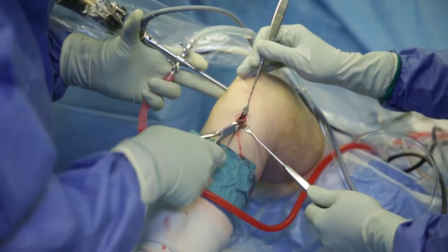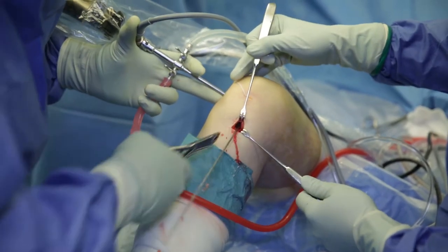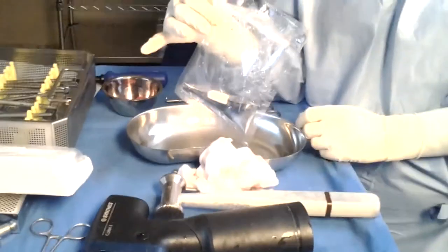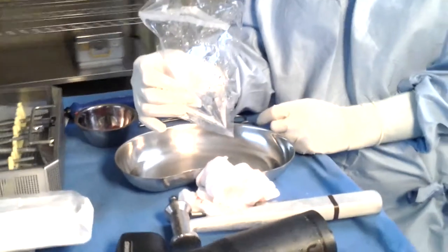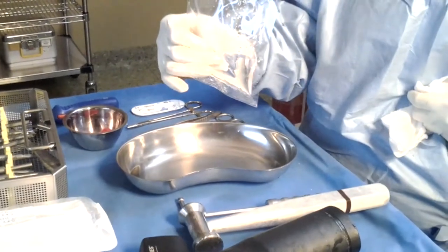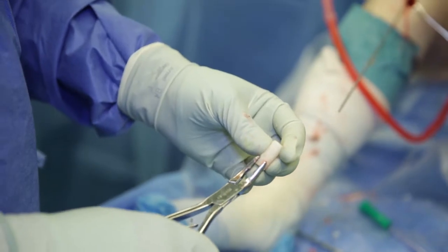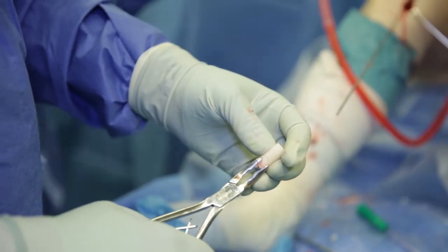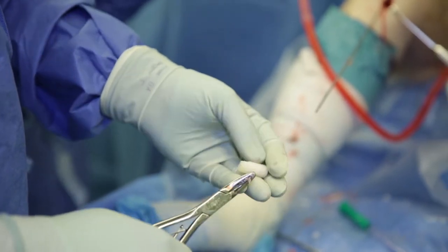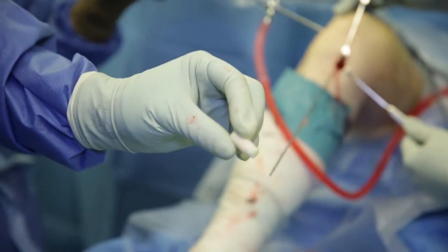In this case, the tibial tunnel was too anterior, so by one-stage revision, we need to do it more posterior. So here you see the bone dowel, which is soaked in saline to get it adequate for implantation. Then we trim the bone so that it can easily be put into the tibial channel without impaction at the front.